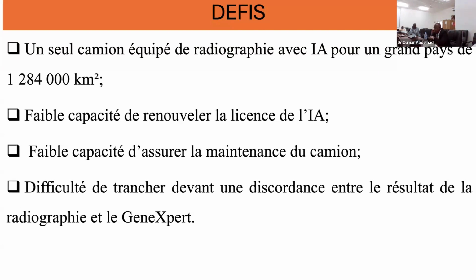In terms of challenges, as my colleague was saying earlier in the chat, Chad is a big country. But unfortunately, our means did not allow us to have more than one truck that is equipped with AI-enabled X-ray technology. So as you can see, the whole part here in the north and center needed the use of X-ray technology with AI to increase the notification of cases.